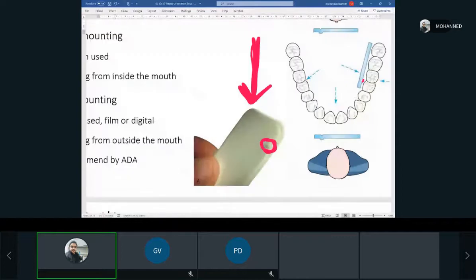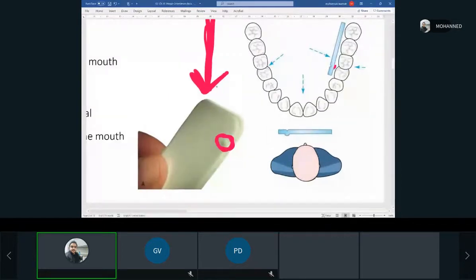So we are taking an X-ray and we have the dot here, right? And then I move around and take an X-ray here and the dot's still here, right? And then move to, so this is the right of the patient, for example, and this is the left, and move and still have the dot here.